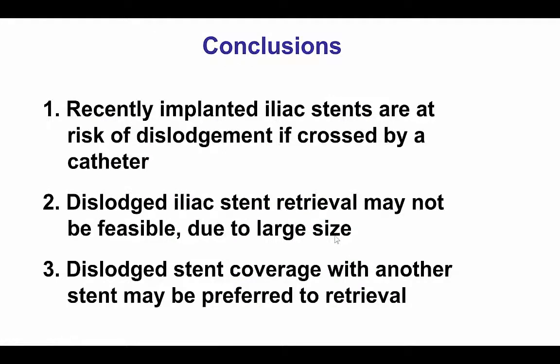This case demonstrates a potential complication if there are recently implanted or even old iliac stents — advancing a catheter through those stents can dislodge them, causing embolization into the aorta or other large vessels. Therefore, one should be very careful about patients with iliac stents. If known, crossing should be performed with extreme caution under fluoroscopic guidance. Ideally, a 45 cm long sheath — now commonly used in CTO interventions — should be advanced through those stents to prevent any effect on previously placed iliac stents.